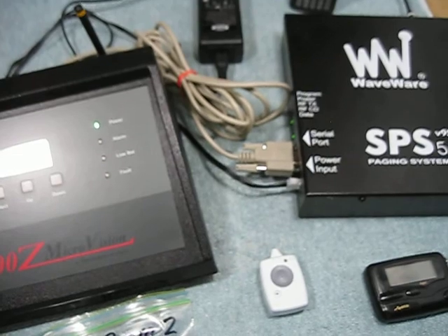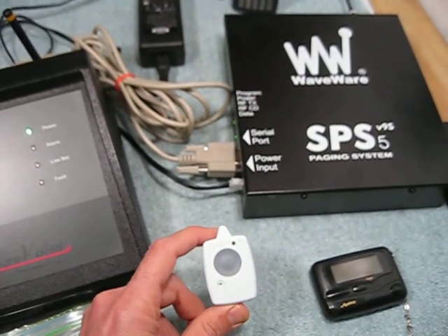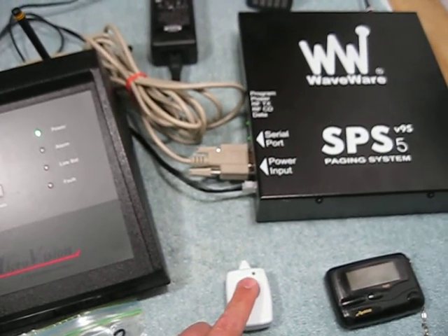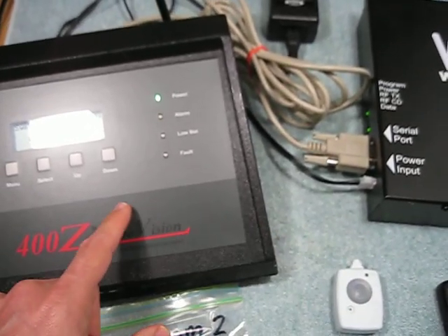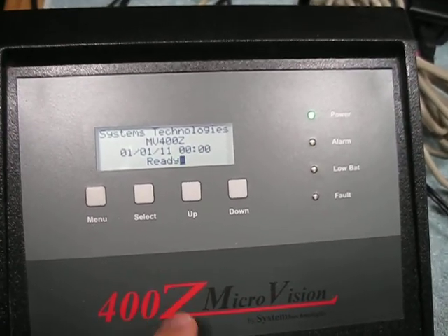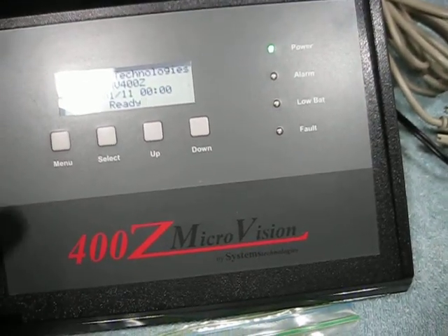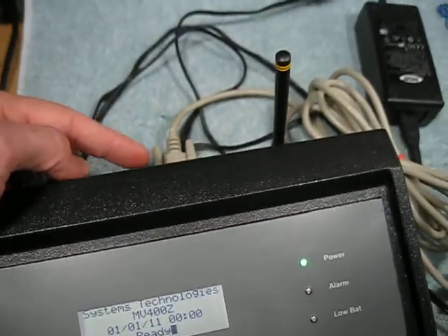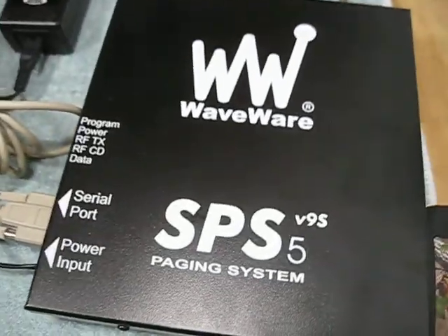It works by having every patient or room with an emergency button, such as this pendant. When this pendant button is pressed, it transmits a signal via 900 MHz spread spectrum to the nurse call unit. The nurse call unit then sends out a beeping alarm at a desk, and also sends a data signal through a serial cable to the paging unit.